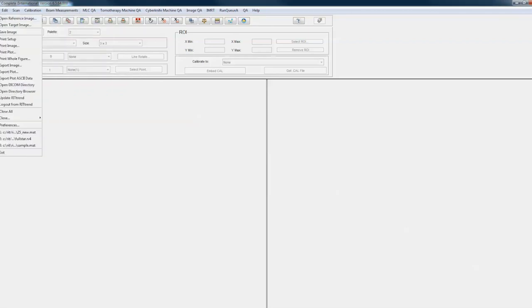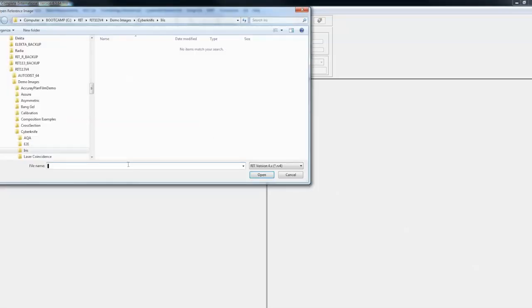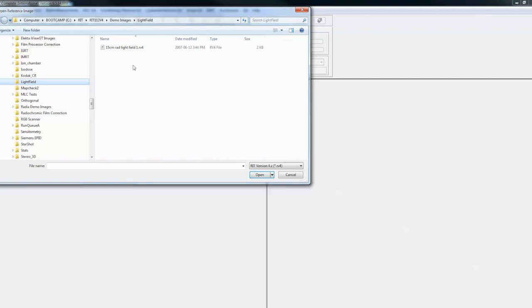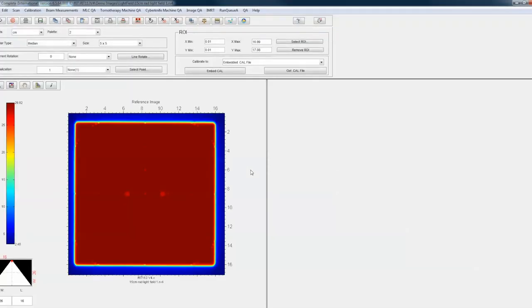First I'm going to open up an image for that. There are a couple of different ways of exposing this and getting the images we need. Let's start with a radiation light field that was done on a piece of film — it doesn't really matter if this was done on film or an EPID. The software can handle either of those cases, and we'll do an EPID case next.